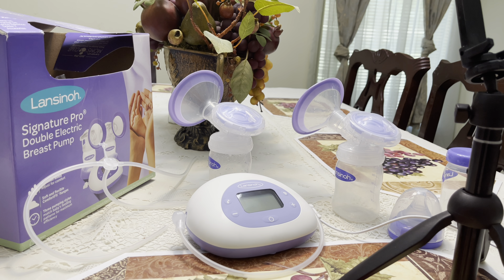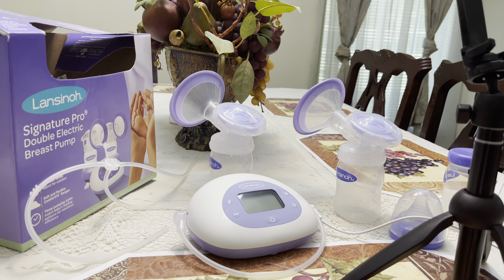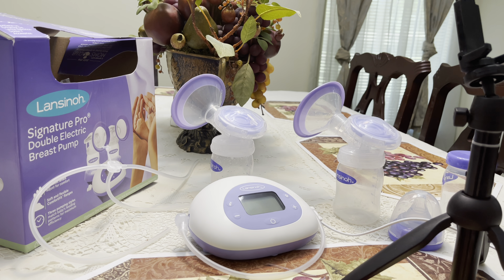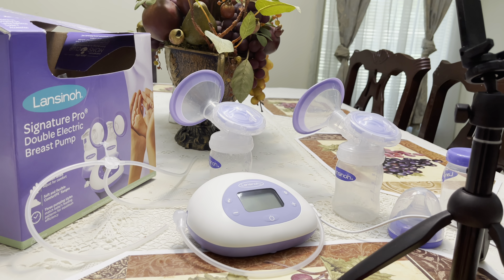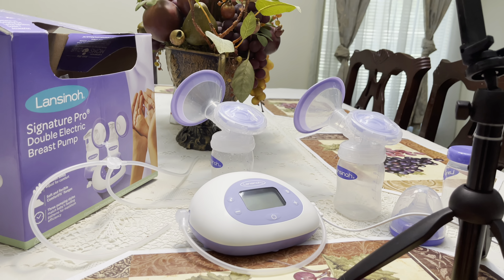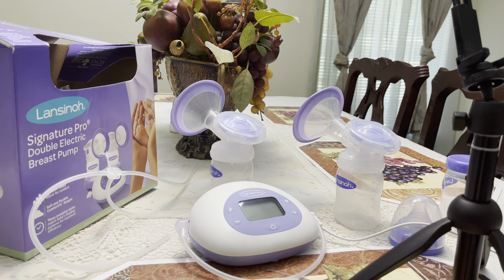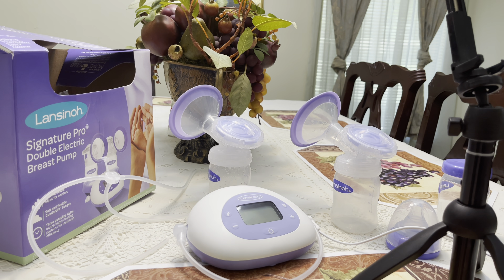I'm sitting here with this little piece and I did not know how to put this stuff together. I tried, I watched YouTube videos, but I just couldn't grasp how to do anything. I was a new mom, this was my first time using a breast pump. It was all foreign to me and I didn't quite understand what I was doing.